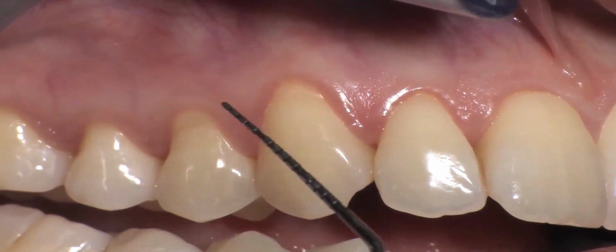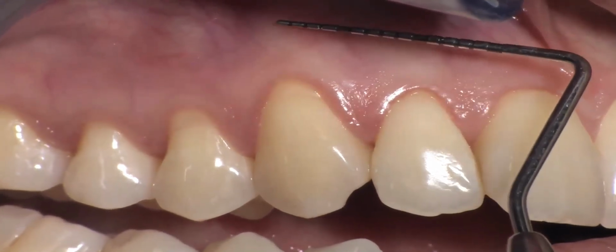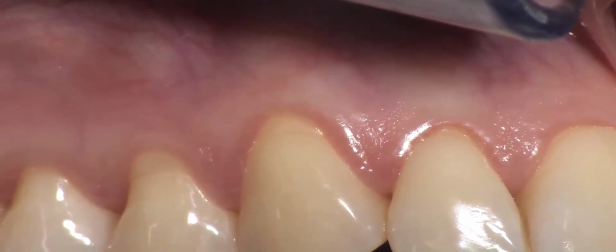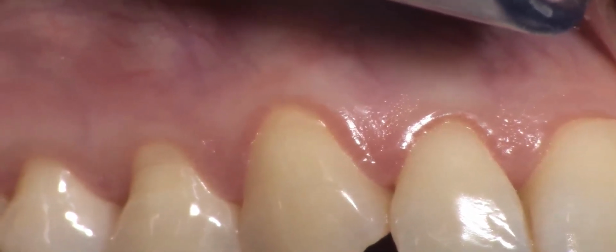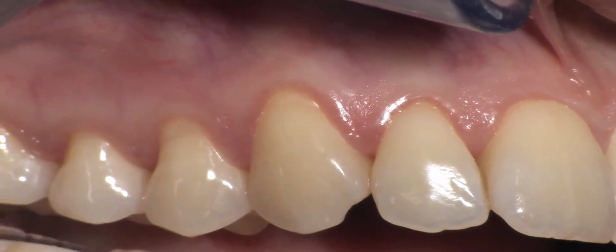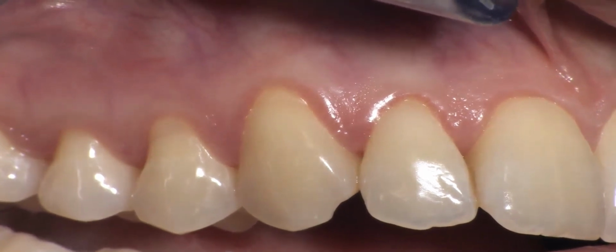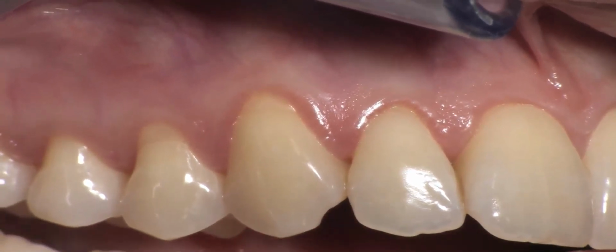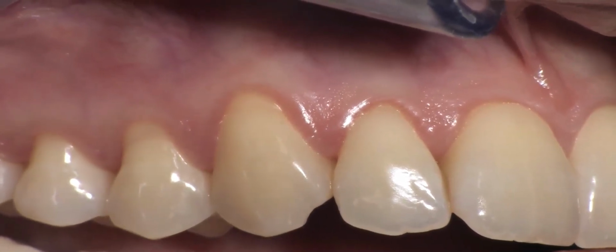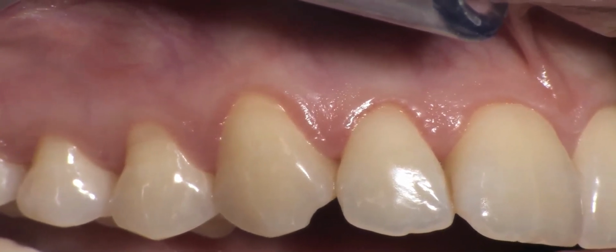In this situation, in which we have good enough keratinized tissue but the thickness of this keratinized tissue is really poor, there is the indication to add the use of a mucograft to the coronally advanced flap. The mucograft, as we will see, is a substitute, a matrix made of collagen, used to improve stability of the blood clot and in such a way improve the healing of the clot under the flap and increase the soft tissue thickness.